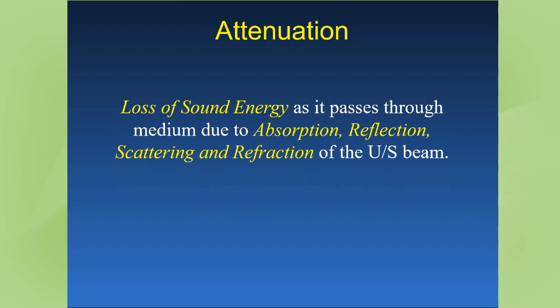And this is due to overall four mechanisms. One, it's due to absorption. It's due to reflection, scattering, and refraction of the ultrasound beam. So it's not just one mechanism, but the loss of sound energy due to these four different mechanisms. Overall, attenuation is frequency dependent. So the higher the frequency, the higher the attenuation. Absorption is frequency dependent. Scattering is a type of reflection. That's frequency dependent. And we'll look later that refraction is also frequency dependent. So the higher the frequency, the more the attenuation occurs.